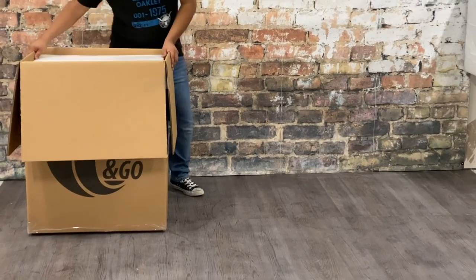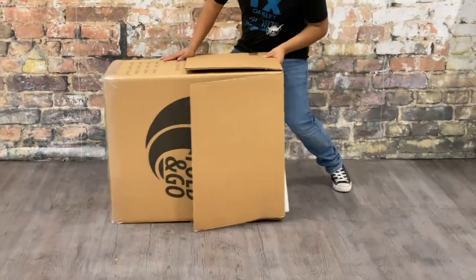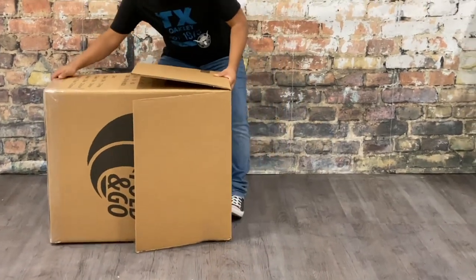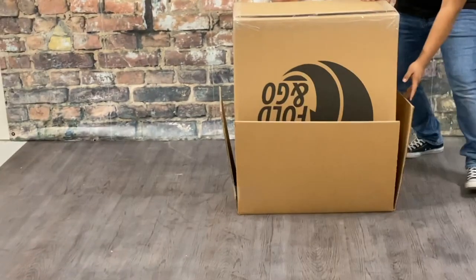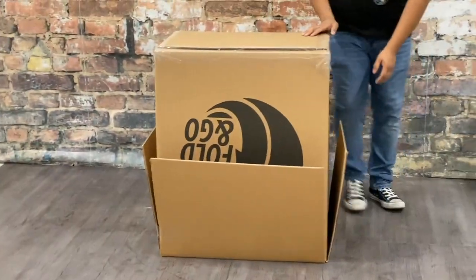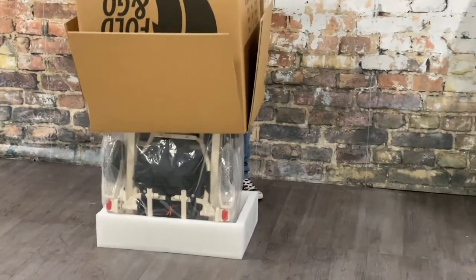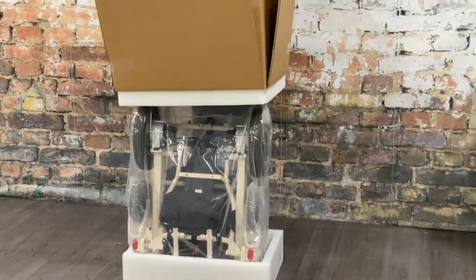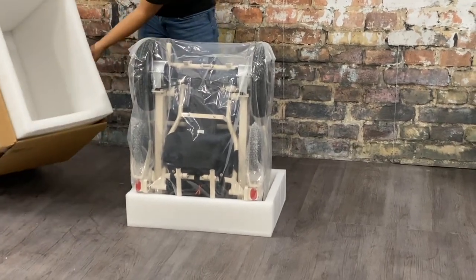Next we're going to do a cartwheel with the box. Lay the box on its side and, depending on how much room you have in your living room, flip it like a pancake so it's on its top. Then grab those flaps that you taped down and lift the box off of the chair. The box is only a couple pounds, so this is a lot easier to lift than the 50-pound chair.